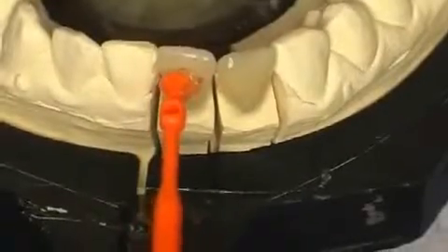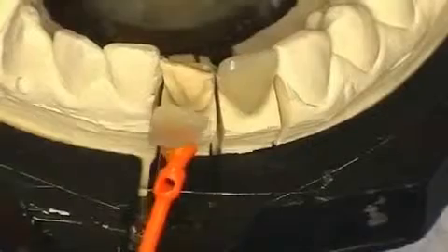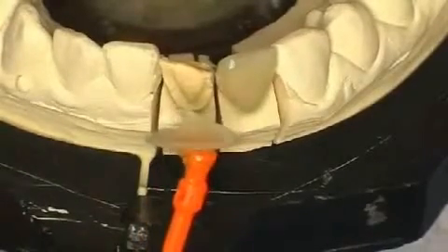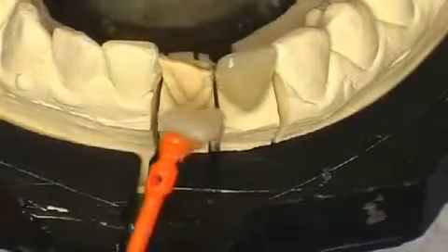A veneer is a wafer-thin, translucent ceramic shell that is placed over the tooth and applied with a special glue. Veneers are predominantly used on the frontal teeth. You see 2 veneers on the plaster model.